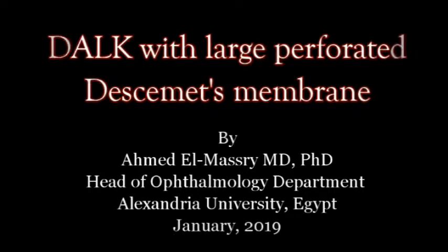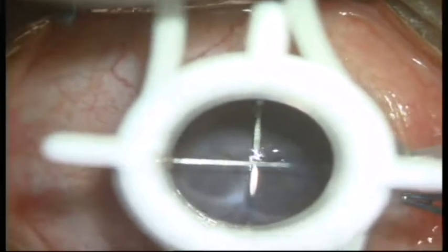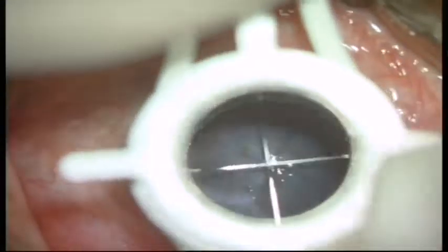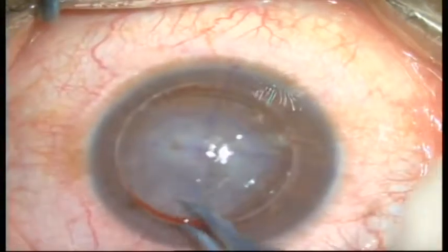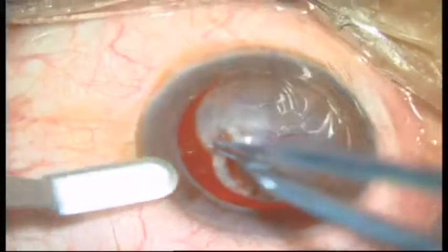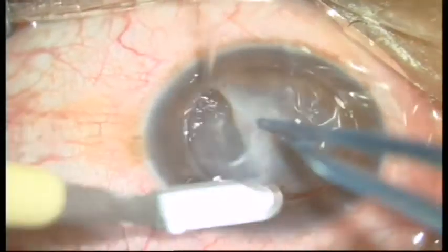Deep anterior lamellar keratoplasty with large perforated Descemet membrane. This patient had a scar in the middle, and we decided to do deep anterior lamellar keratoplasty as the anterior segment OCT showed an intact endothelium and Descemet membrane. As you see here, there is some vascularization.